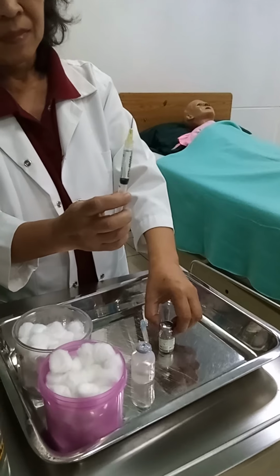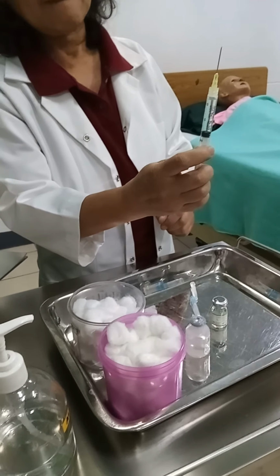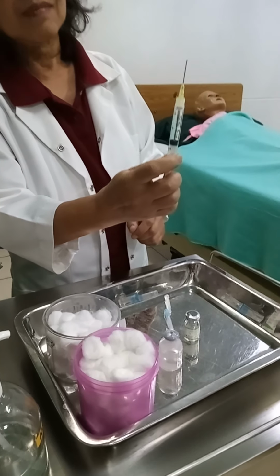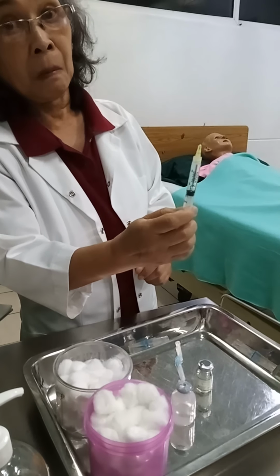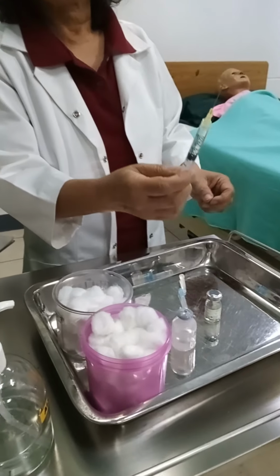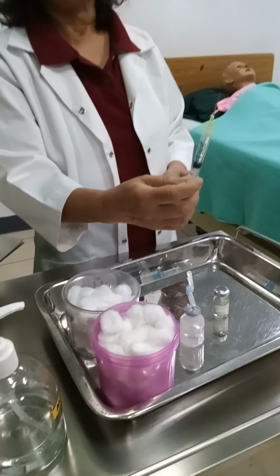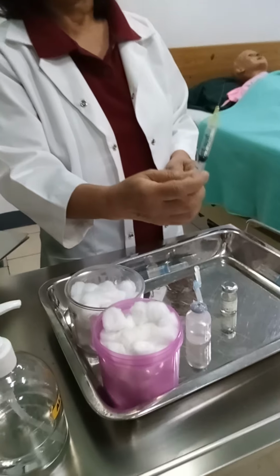When the desired amount has been obtained, position the needle into the vial's airspace, tap the side of the syringe to dislodge air bubbles and inject the air into the vial. Anyway, this will be discussed when we have the lecture on demonstration of withdrawing and aspirating medications from a vial.